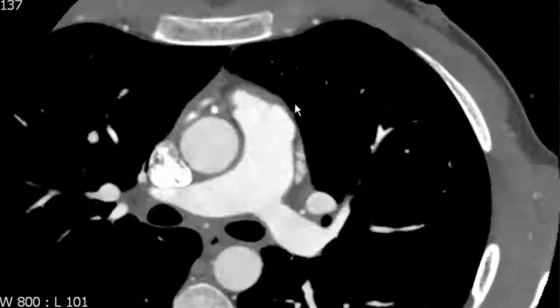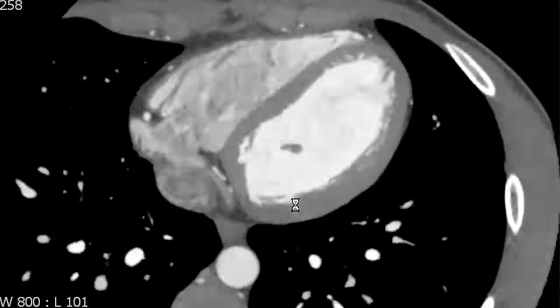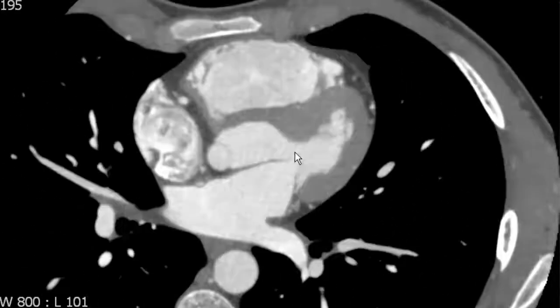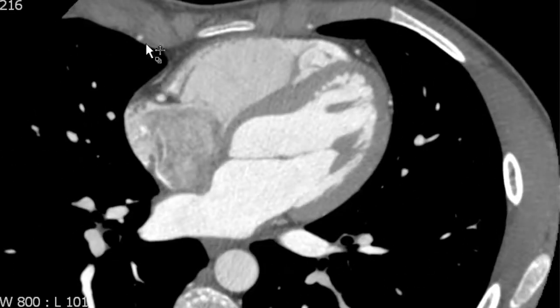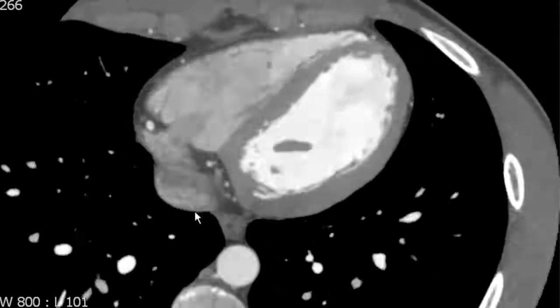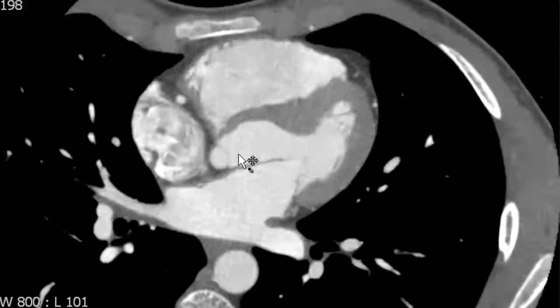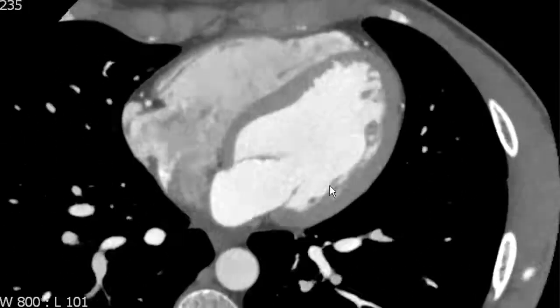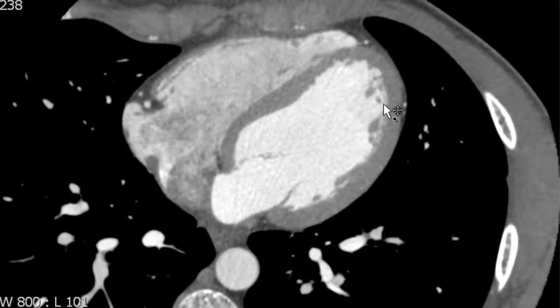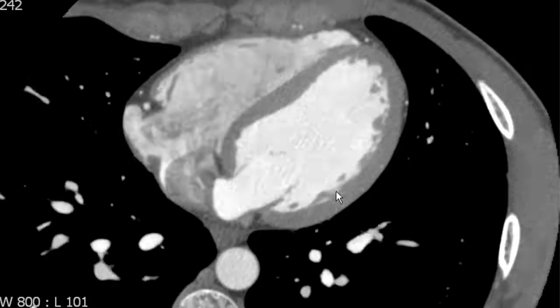So we've reviewed the four chambers of the heart, which we'll talk about in detail momentarily. Again, they are: the left atrium, closest to the vertebral body; the right atrium; the right ventricle, which is just under the sternum; and the left ventricle, which has the thickest muscular wall.